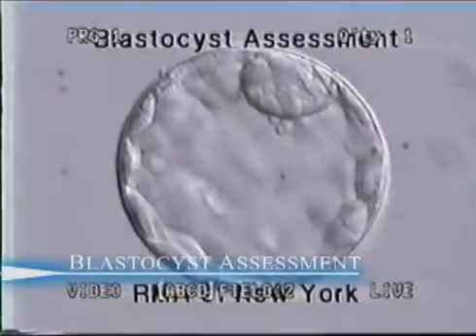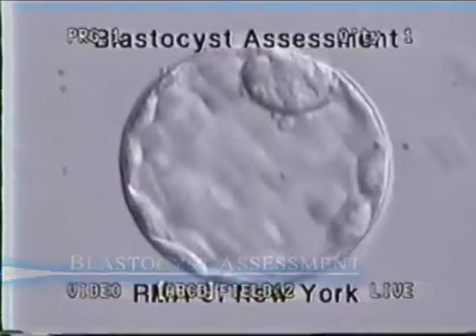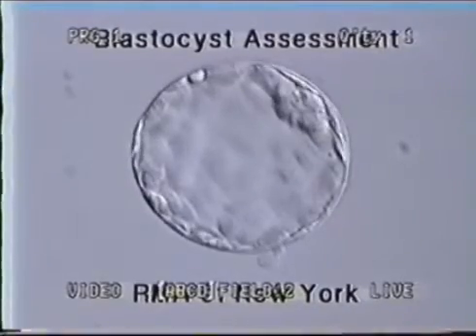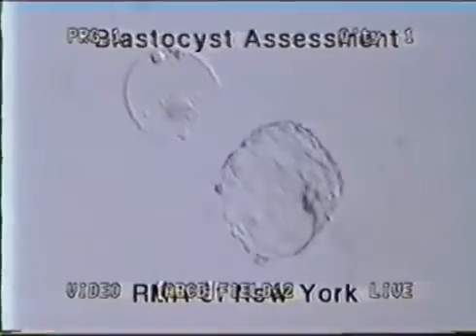If embryos are cultured past day 3, their development will be assessed on day 5 and day 6. The embryos, now called blastocysts, are assessed for potential transfer or freezing. They can range in quality as characterized by their size and the organization of cells that are beginning to differentiate around the fluid-filled blastocoel cavity.